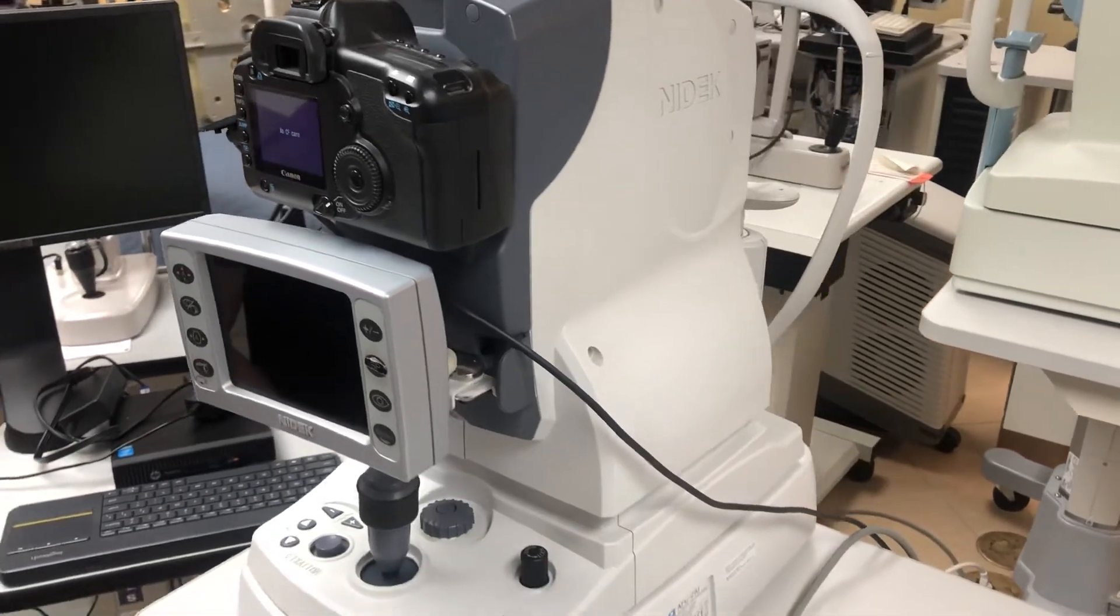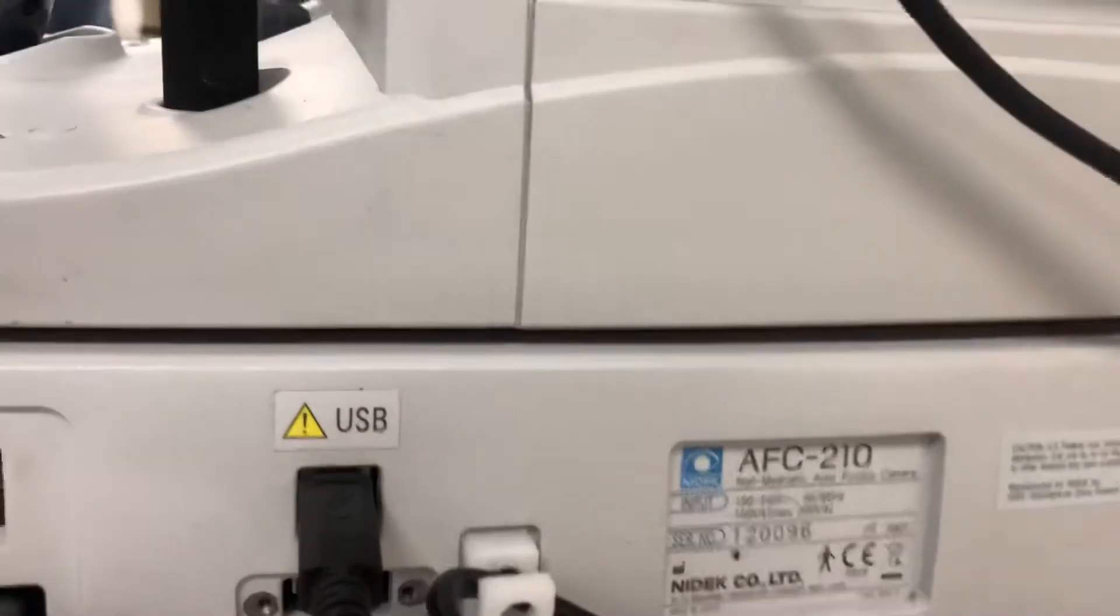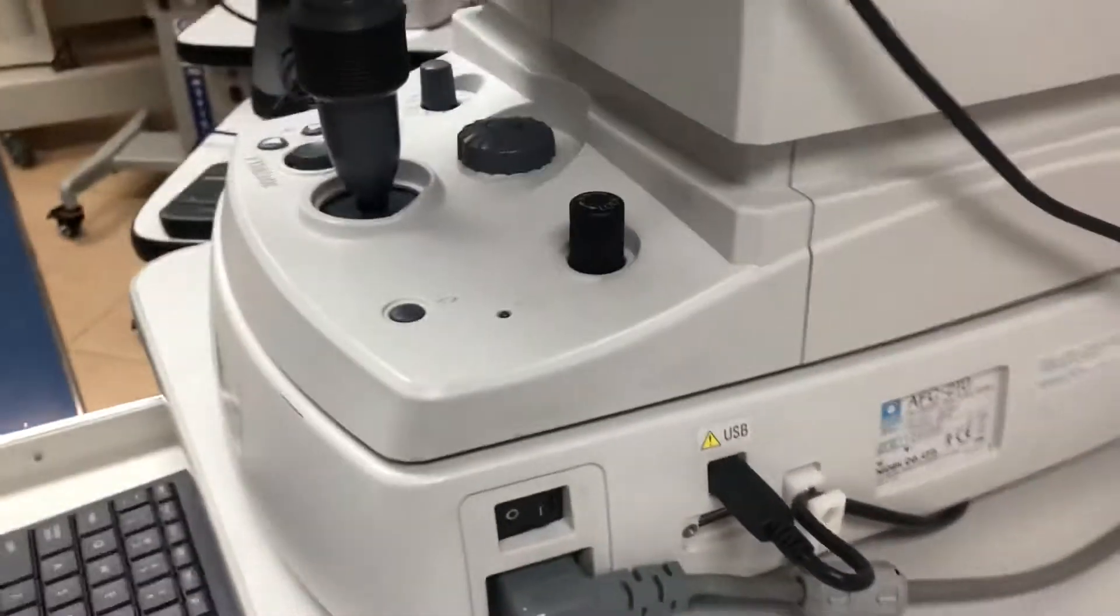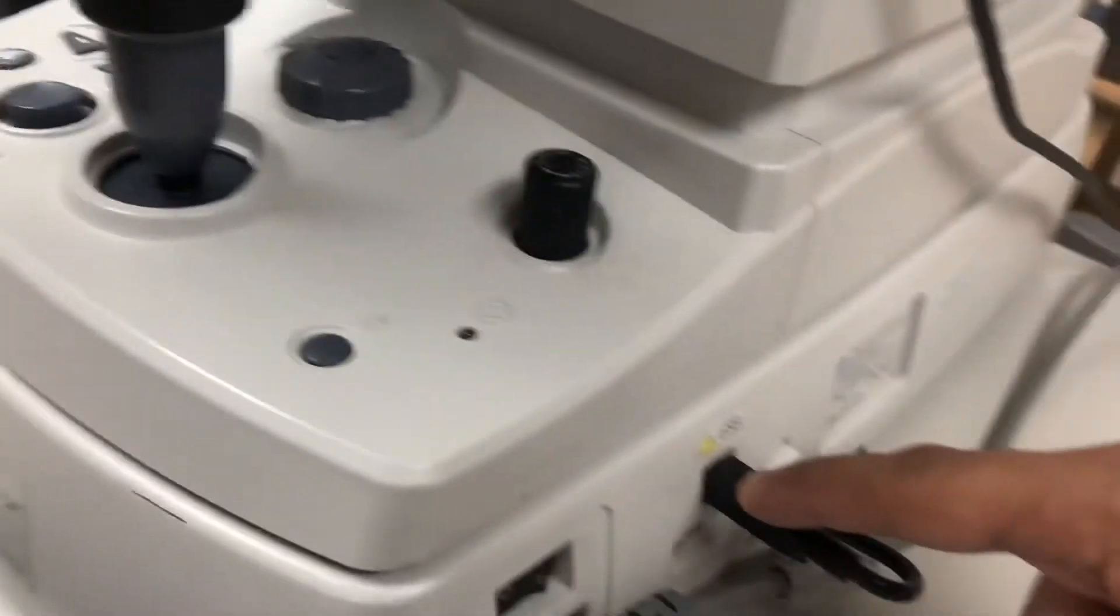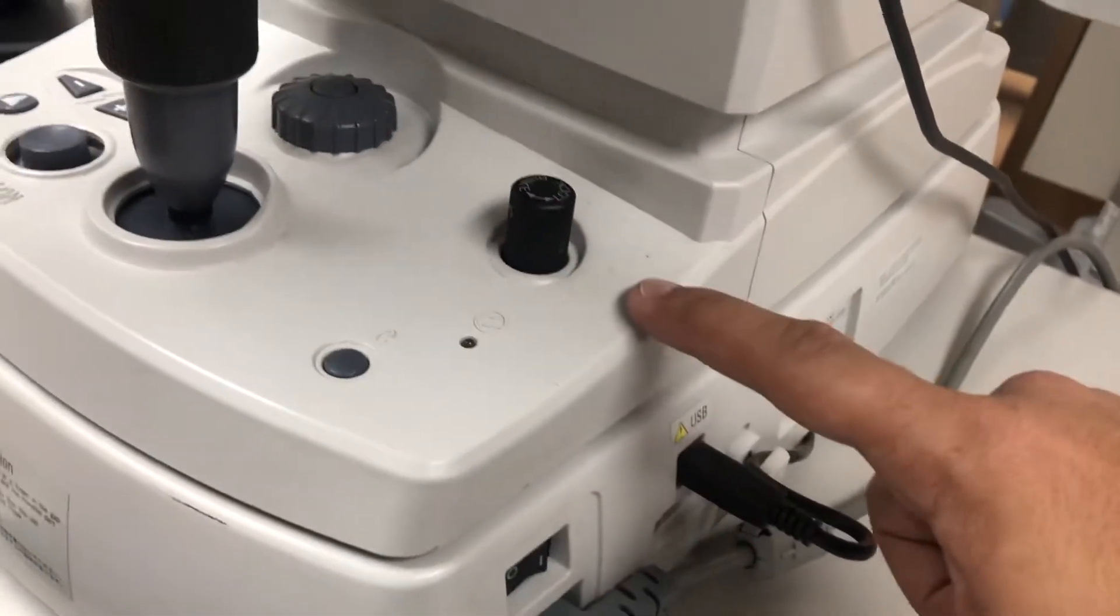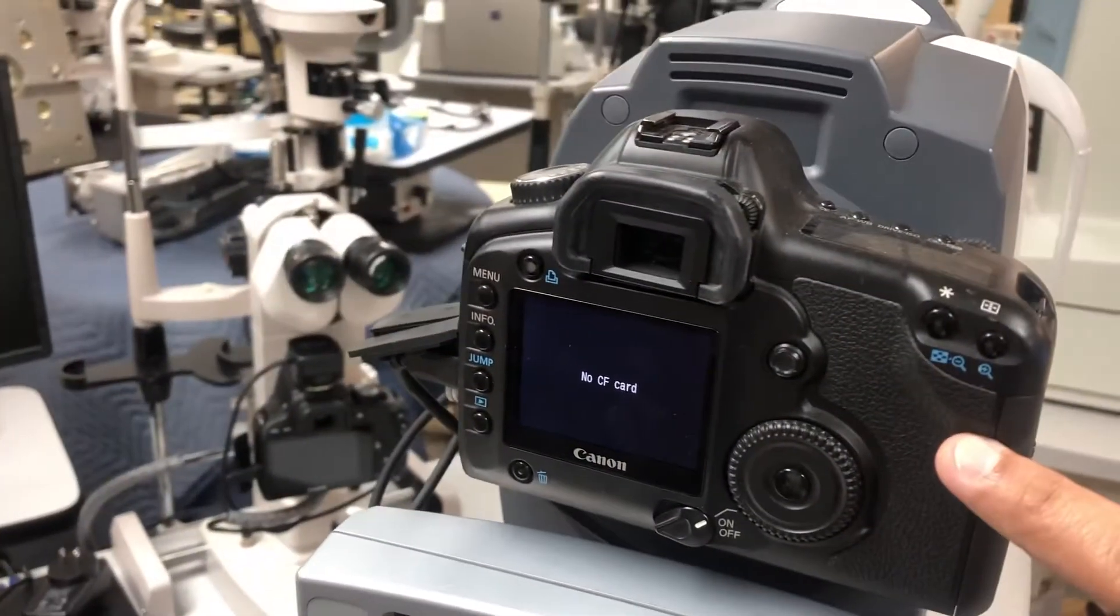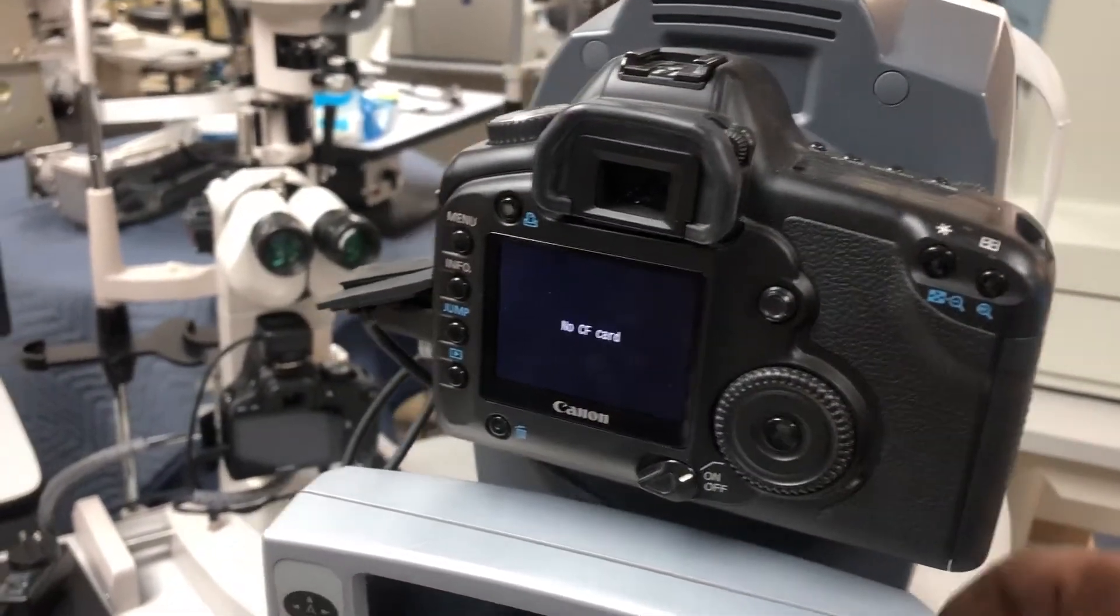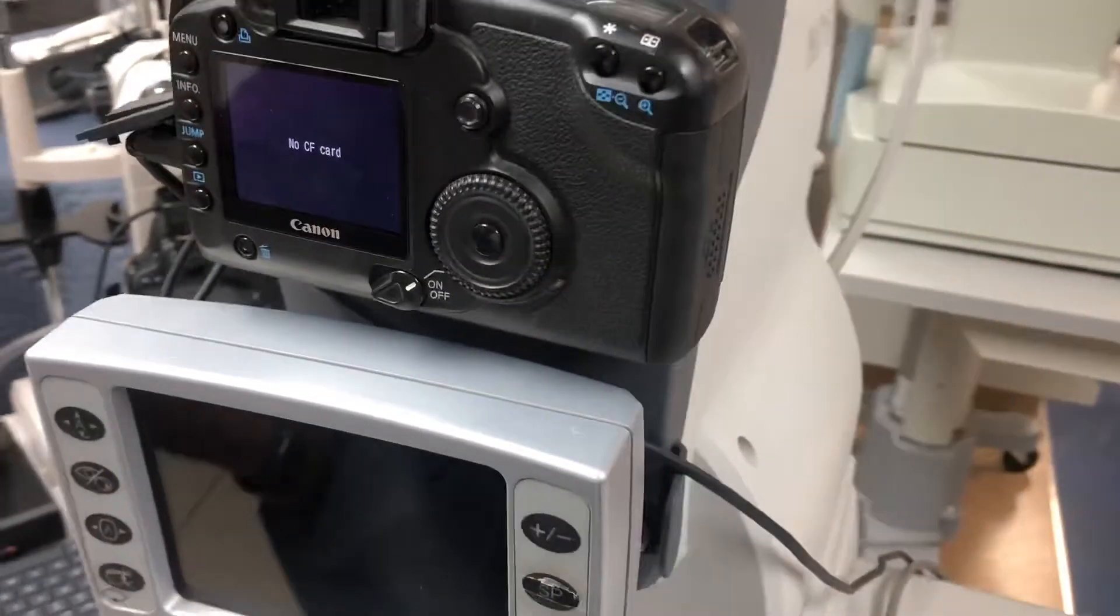Good afternoon. Here we have the NIDEC AFC fundus camera, a non-mydriatic system with a very simple setup. If you look here, there's one USB cable that goes from the unit into the computer, and from the Canon camera itself there's also a USB cable that connects to the computer as well.